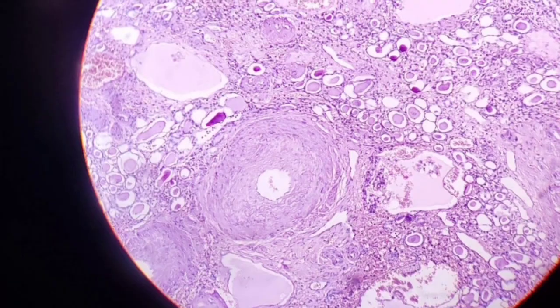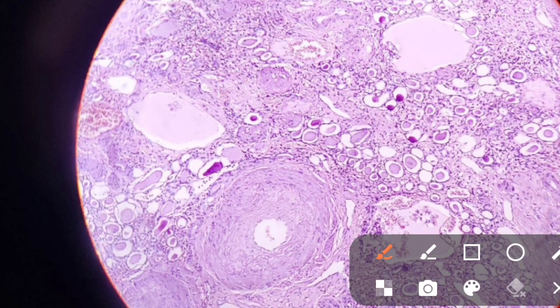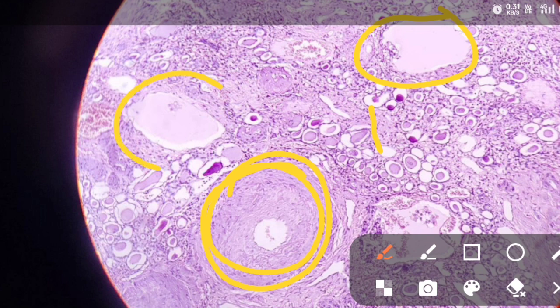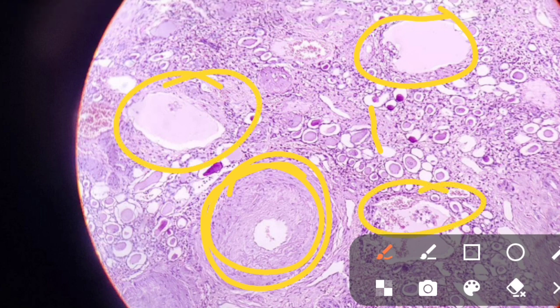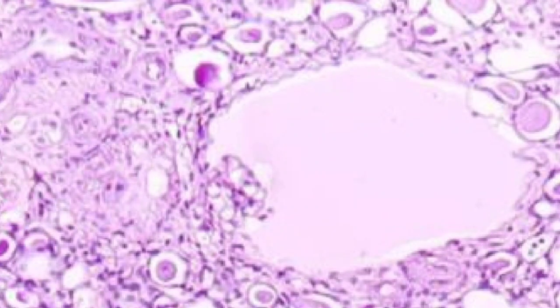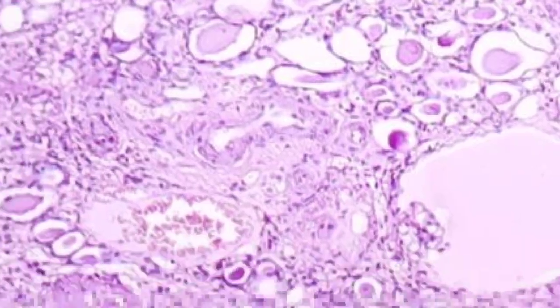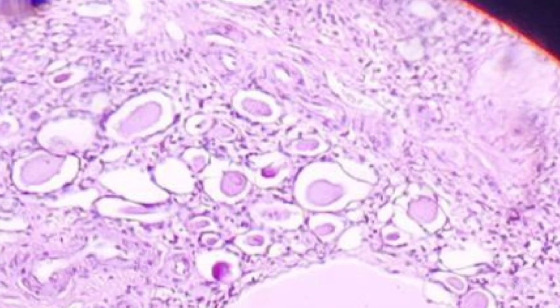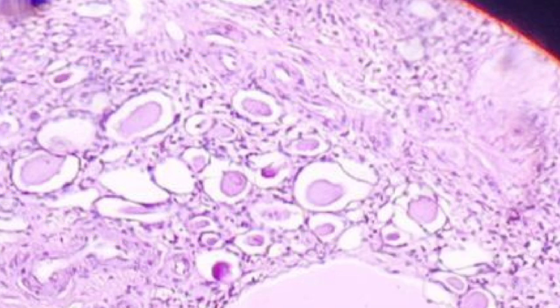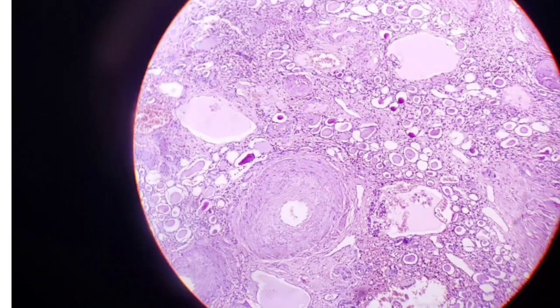Next is chronic pyelonephritis (CPN). This is a very informative picture — you can see hyalinization of the arteriole, glomeruli with periglomerular fibrosis, chronic lymphocytic infiltration, and most importantly, thyroidization of the tubules. Thyroidization means the tubules look like thyroid follicles filled with colloid. One picture summarizes all features of chronic pyelonephritis.